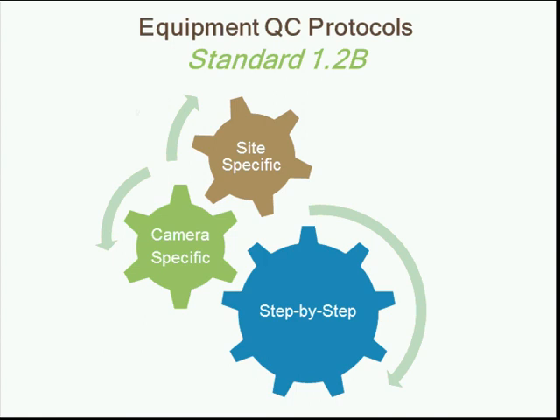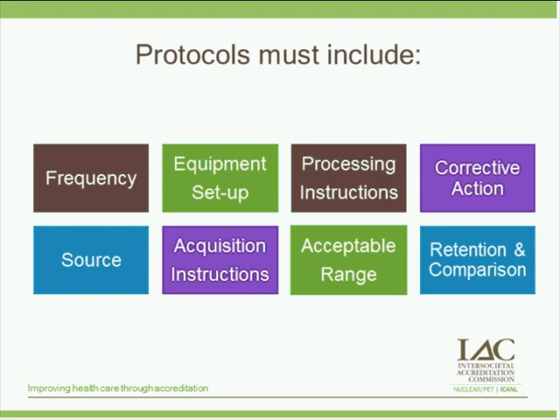Again, the protocols must be site-specific and camera-specific, and they must be step-by-step. The quality control protocols must include frequency of test performance. Is the test done daily, weekly, monthly, or quarterly? Type and location of source, if applicable. Is a sheet source or a fillable source used?